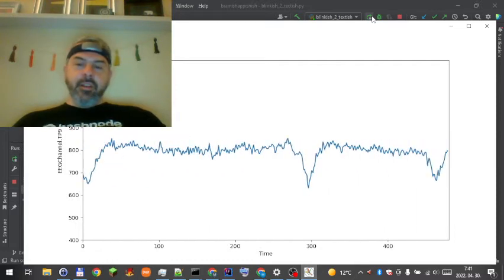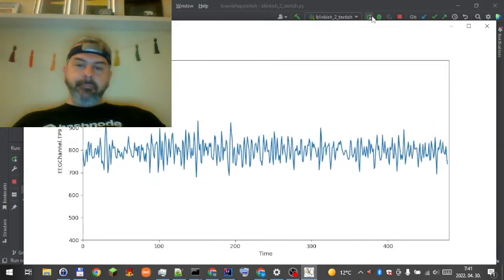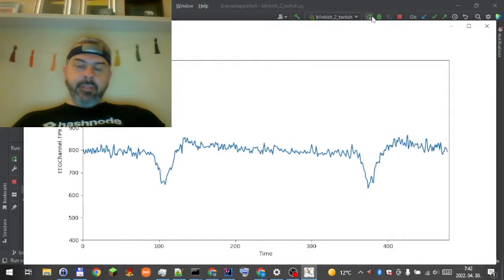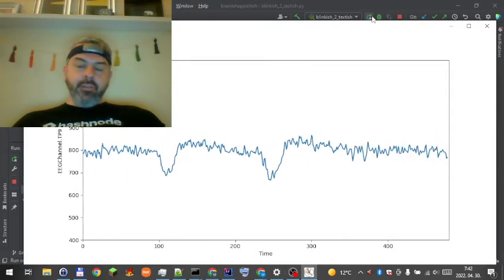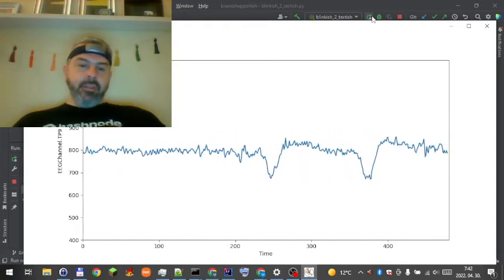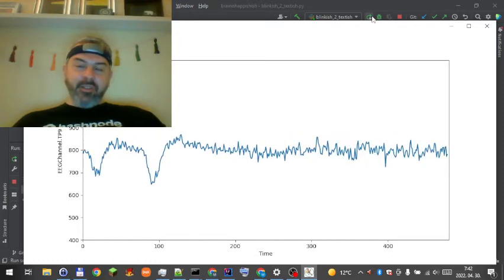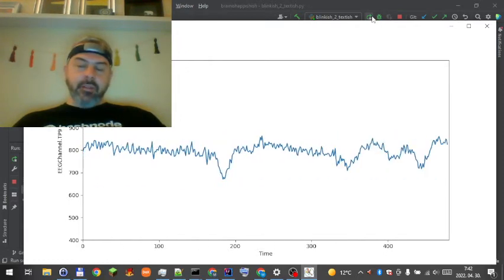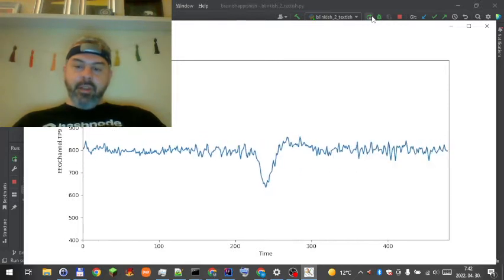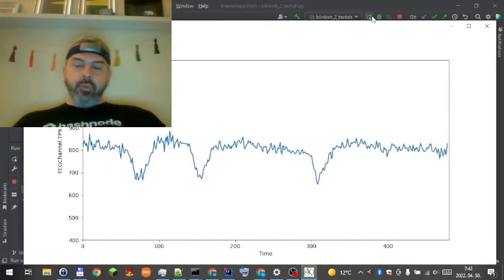Let's see one more thing. What if I clench my jaw? You see, if high frequency signal appeared, it's very strange. Let's do it again. Amazing, I would say. At least I'm pretty amazed by brainwaves, and I just started to work with them, so I'm pretty curious where I am in a half year, a year, or even more. I think it's a very fun project what I am doing at the moment, and also what the plans I have for the future.